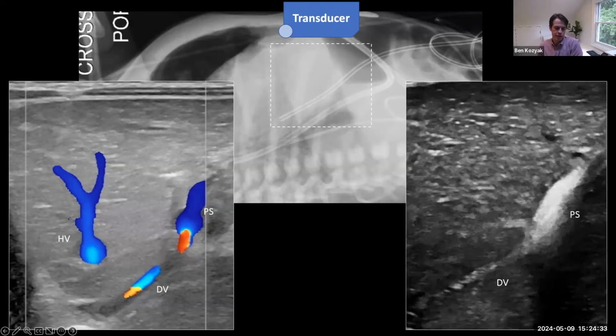You can also demonstrate ductus venosus patency with agitated saline injected into the low-lying UV, and that saline contrast allows you to really visualize the anatomy nicely and get sort of a roadmap of where you want your catheter to go. You can also see some of the hazards. Whereas a catheter coming here, you want it to go here, it might want to hang up here. This starts to give a sense of what we'll be looking at.